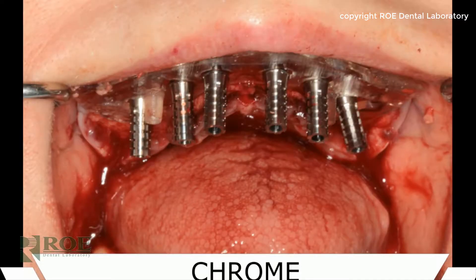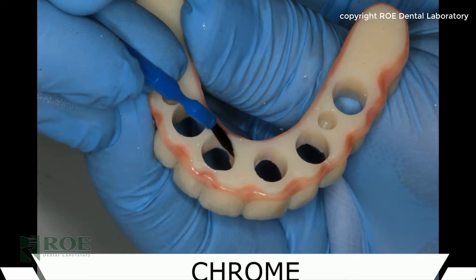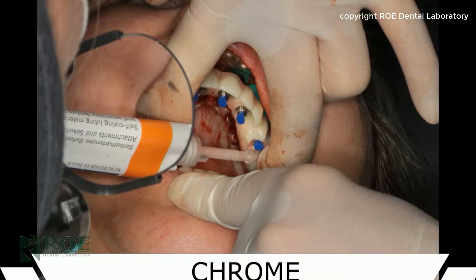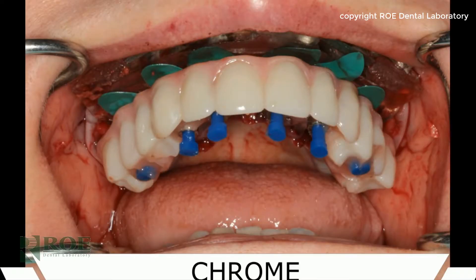The doctor then seated the custom green blockout gaskets and applied adhesive to the prosthetic — in this case the doctor used VOCO, and you must use an adhesive. The prosthetic is seated, the blue plugs are placed inside each temp cylinder, and the VOCO material is applied to the table to time the seating and setting. The material is then used to backfill the void between the prosthetic and the temp cylinders.